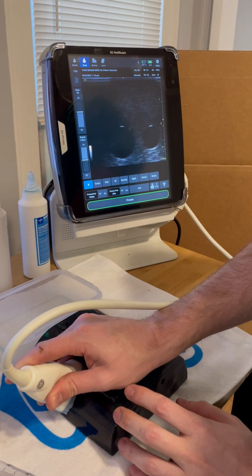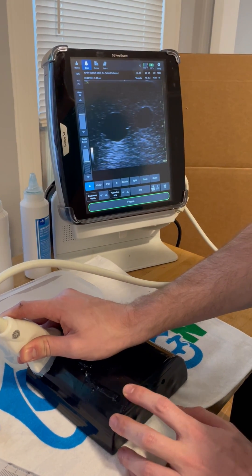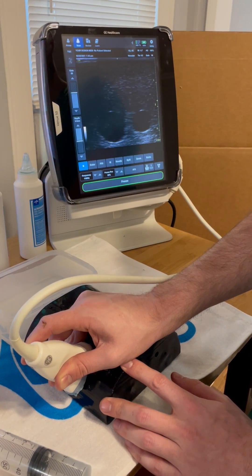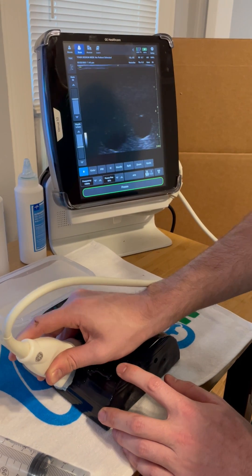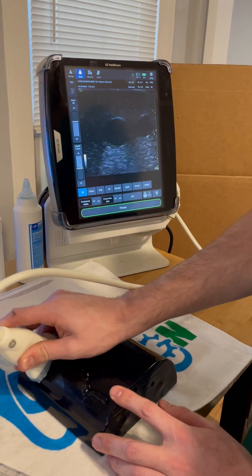In the model, as I advance up the model, you'll find that the vessels become much more shallow and a far easier target to hit. And as I come back in the model, they get much deeper and much harder to approach. So you can change the difficulty setting for the learner by instructing them where they can insert — shallow or deep.